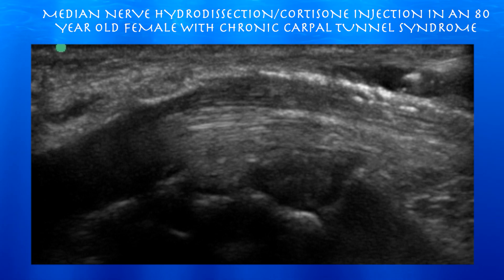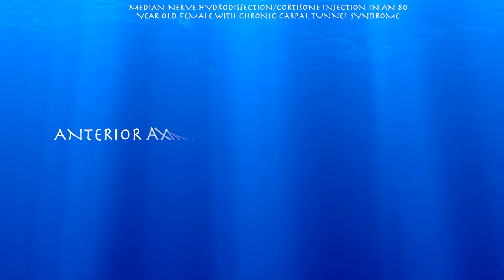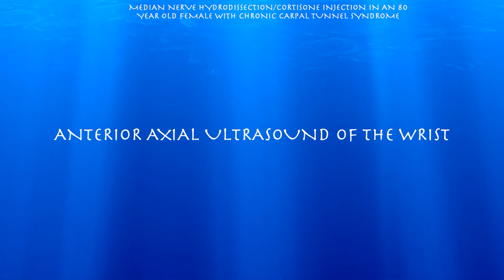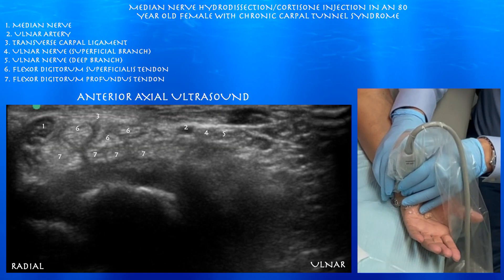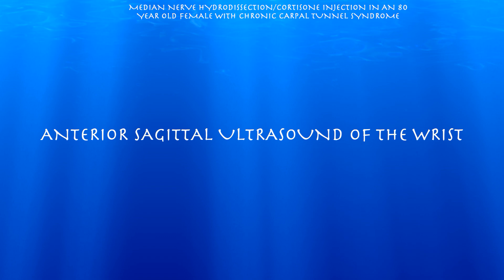Here we're going to go over a hydrodissection and cortisone injection for chronic carpal tunnel syndrome in an 80-year-old female. Here we're going to look at the wrist in an axial plane. This is our essentially home base view of the wrist. Here you can see the median nerve. You can appreciate the flexor digitorum superficialis and profundus tendons, as well as the ulnar artery and nerve.